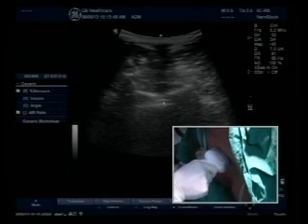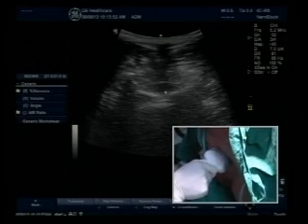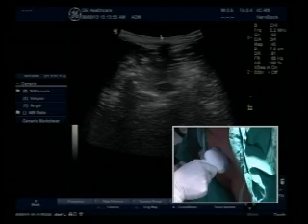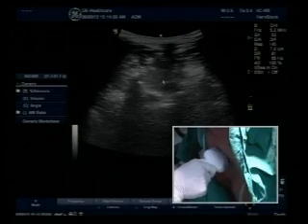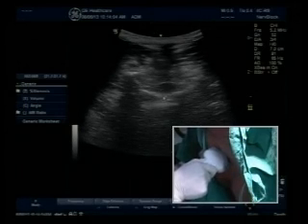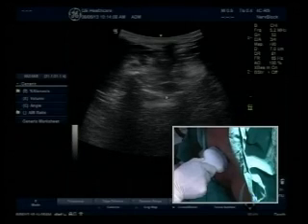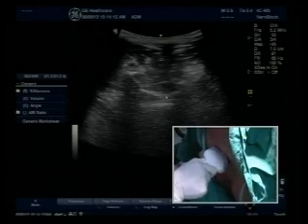So now I'm moving it slowly upwards because now I can see between the spines. So that is interspinous. And what you're seeing, the blackish line from the yellow pointer downwards, is the interspinous ligament. And then what you're seeing is the posterior complex, which consists of ligamentum flavum and dura. Please freeze the picture. So what you're seeing is now ligamentum flavum and dura.